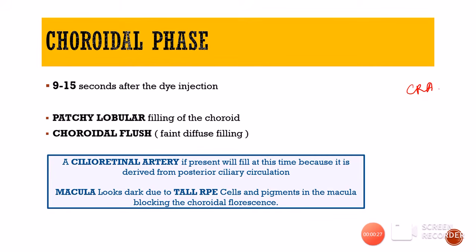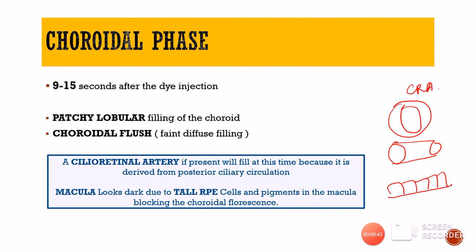The sodium fluorescein is going to quickly diffuse, and it can go within the fluid compartments of the eyeball. However, it will not be able to pass so easily through the retinal vessels and through the RPE. Therefore, whenever we are doing fundus fluorescein angiography, we are actually testing the integrity of the blood retina barrier. So this is a very important point that we must remember.